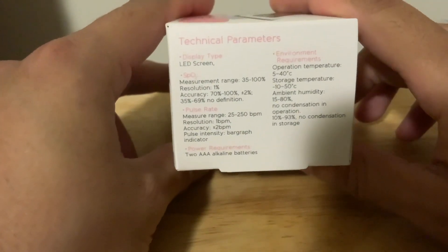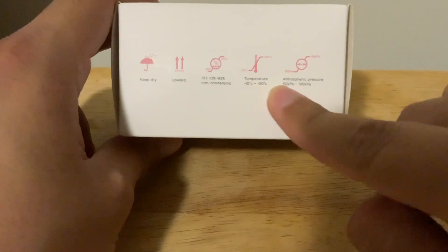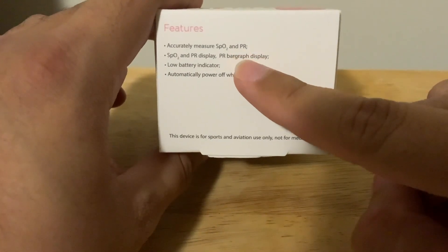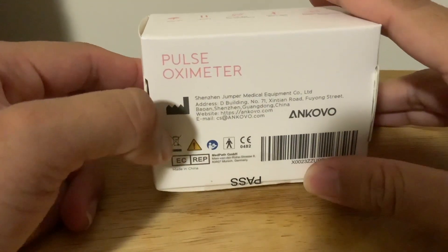Here are the technical parameters. We've got some kind of indications here. These are the features. And it's the company that made it in China.